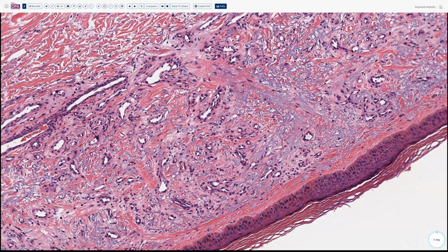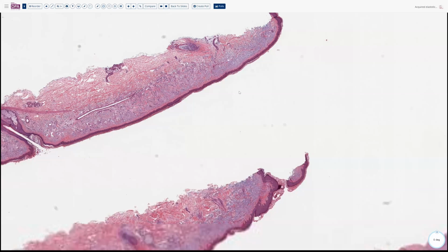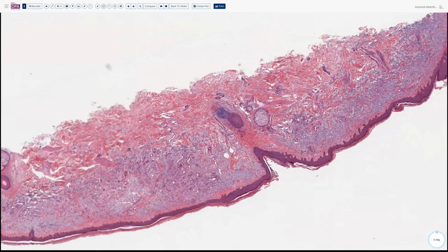No significant atypia, not a sarcoma by any means, but more prominent vessels than you would expect in this situation, and not typically following exactly the sort of superficial capillary plexus that you would expect with the skin site. And here you can see that it tends to proliferate a little bit more and even go a little deeper with some of these areas like this.